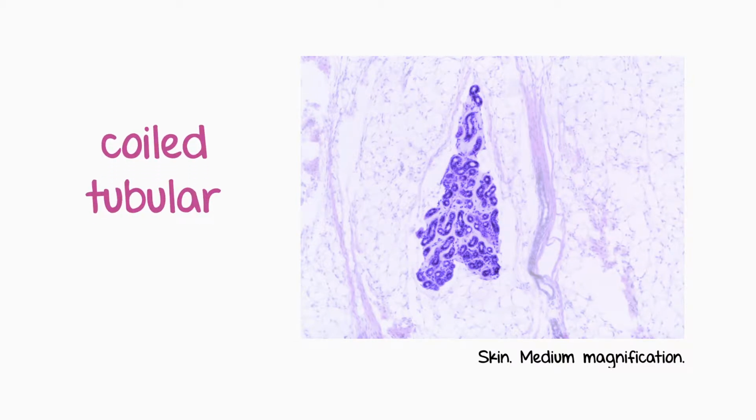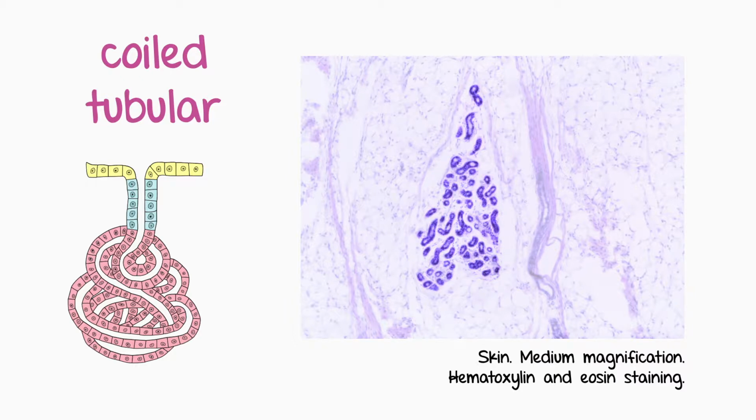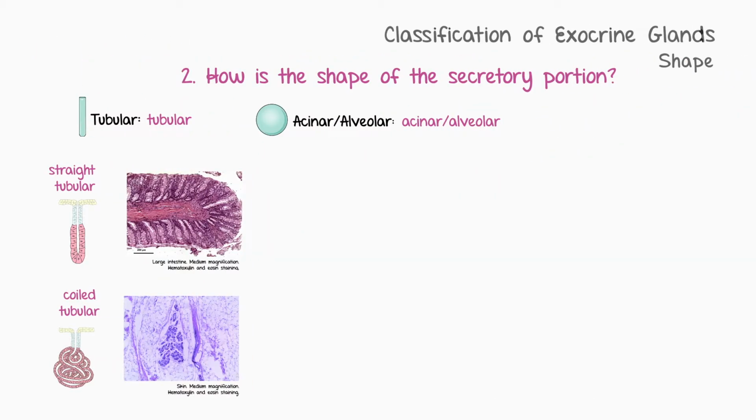Due to the fact that the histological section provides a 2-dimensional view of a 3-dimensional structure, what we see are several fragments of secretory tubules formed by large columnar or pyramidal epithelial cells. When cells of the secretory portion are organized in a spherical shape, they may receive 2 designations: acinus and alveolus.